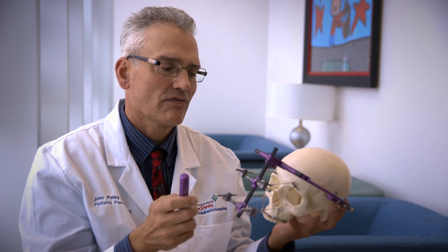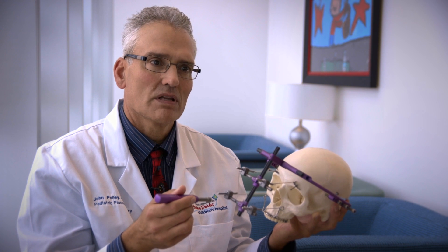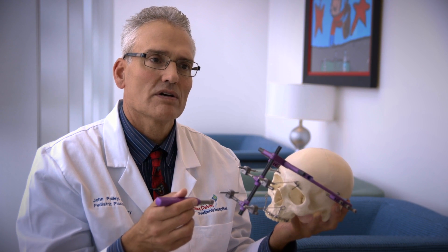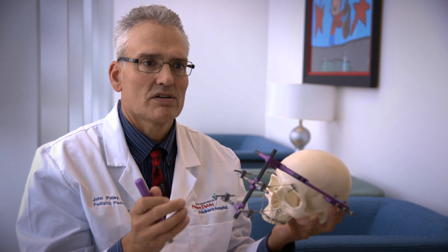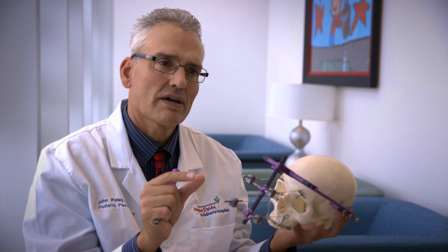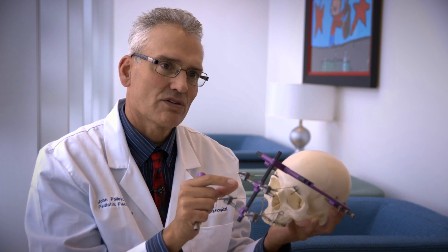One full revolution of this screwdriver is half a millimeter. Typically the distraction rate for most patients is approximately a millimeter a day, so we have the parents turn once at night for half a millimeter and once in the morning for another half a millimeter. It's pain-free because that small amount of movement is imperceptible to the patient, but it's enough to just open the fracture site we created. The body sees that fracture and lays down new bone. The next day we turn again, pull forward gently — another fracture, more new bone. That's how it works.